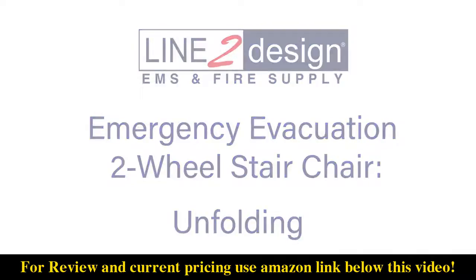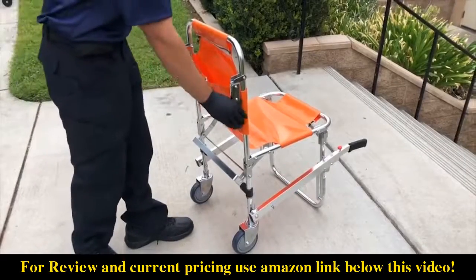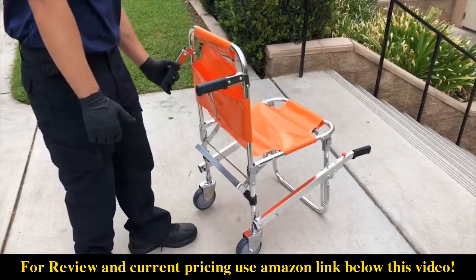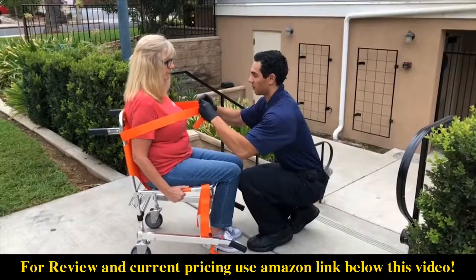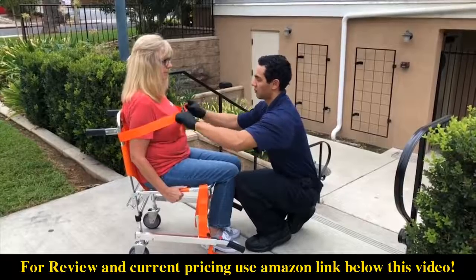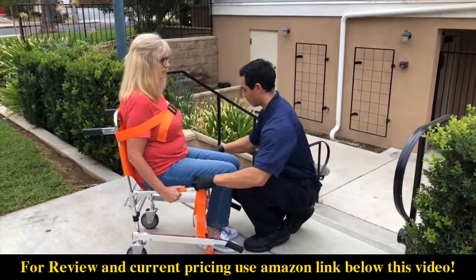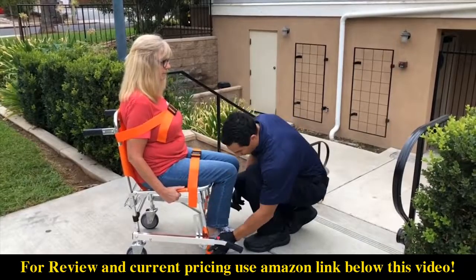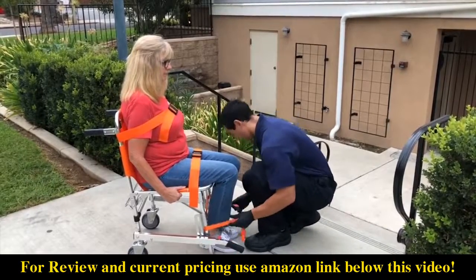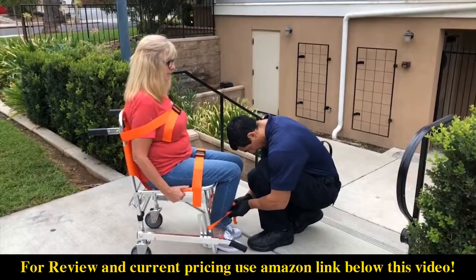To place a patient in the stair chair, unfold the rear carrying handles by grasping and pulling upward on the handles. Note that rear handles do not lock in a stationary position. Unlatch all three safety straps and position the patient in the chair. Buckle chest, waist and leg straps around the patient. Tighten safety straps to ensure the patient is secure. Have a second operator double check all safety straps before operating.